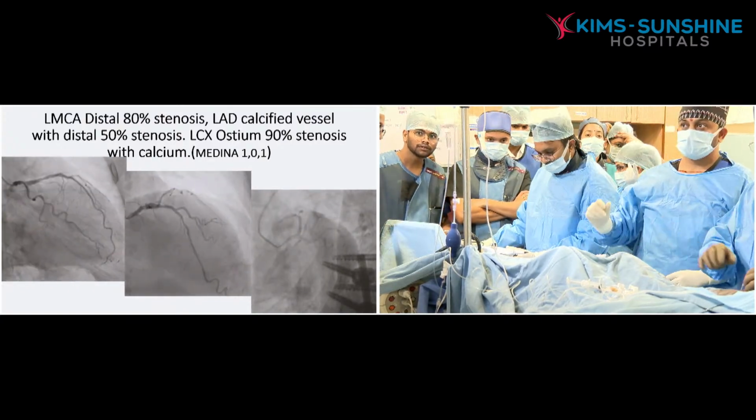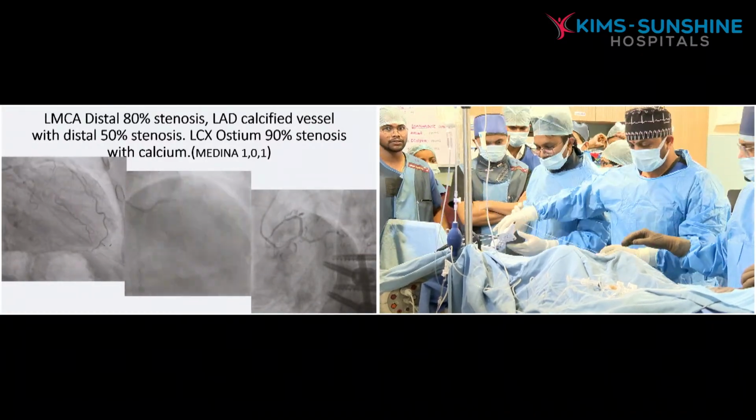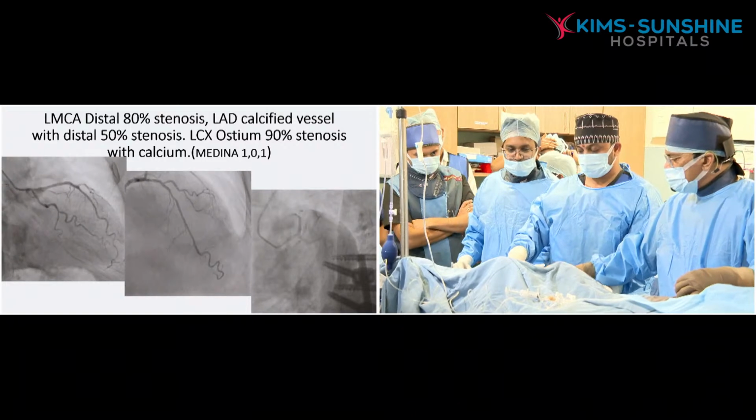Outside we have to see the burr once. Let us see the burr movement. Keep it here. Keep it here. Yes. Tap it, sir.